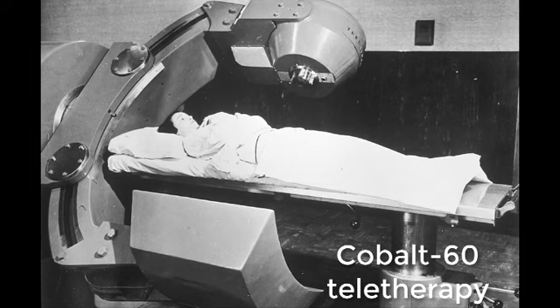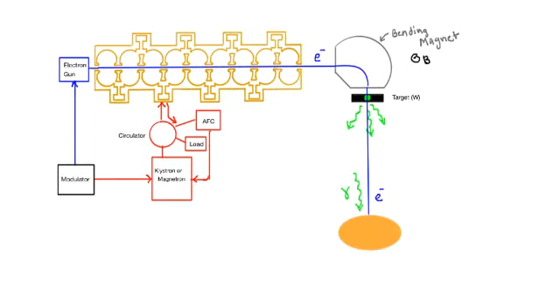And these cobalt teletherapy units remained a workhorse for radiotherapy for 20 years until the 1970s, when they became gradually replaced by linear accelerators, at least in North America and Western Europe. So linear accelerator technology is quite a bit more complex than a simple cobalt source, as you'll appreciate from the previous videos, but the investment and development was thought to be justified. So let's stick with the history for a moment.